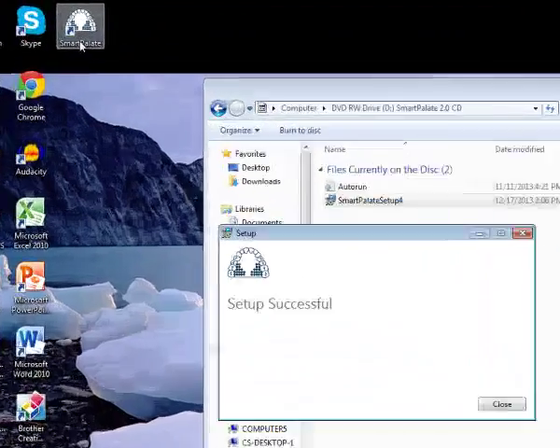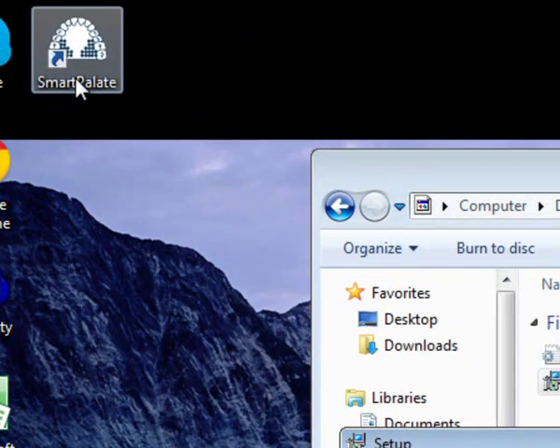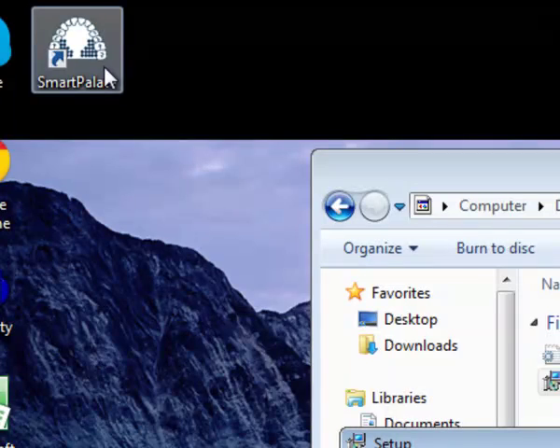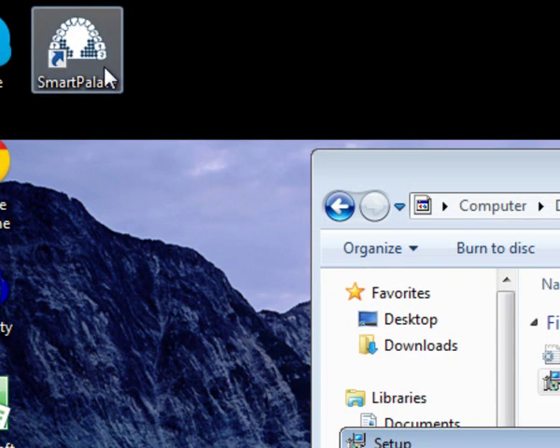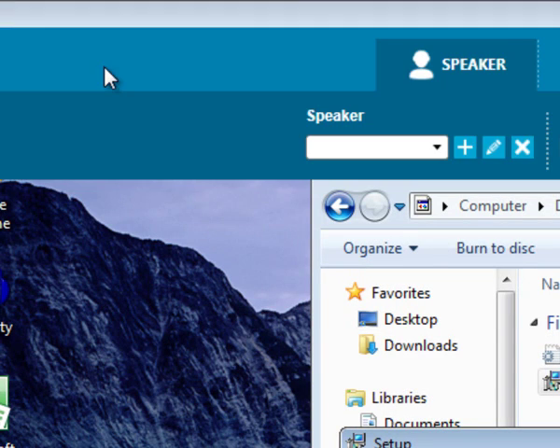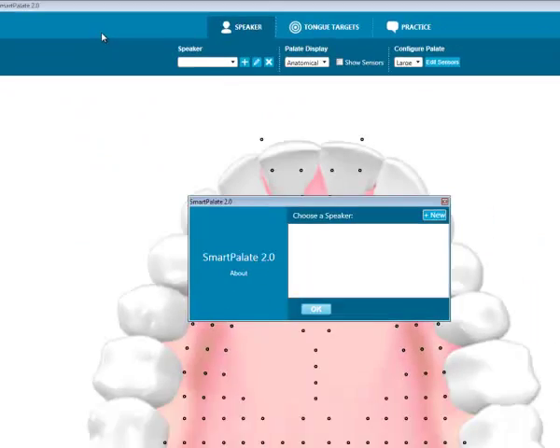Once the installation is complete, you will see this icon appear on your desktop. Double click to launch the SmartPalate software.